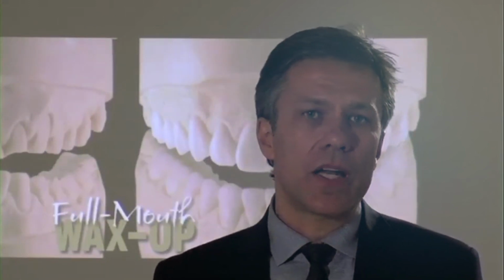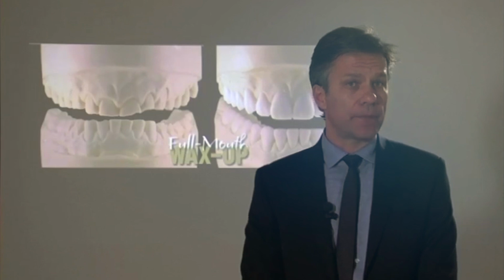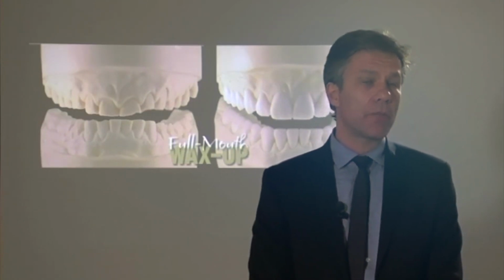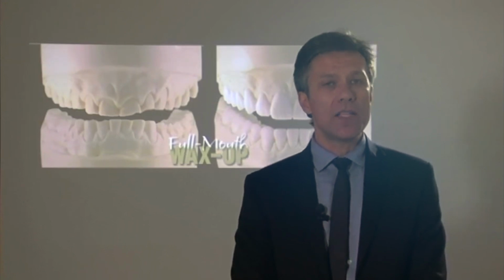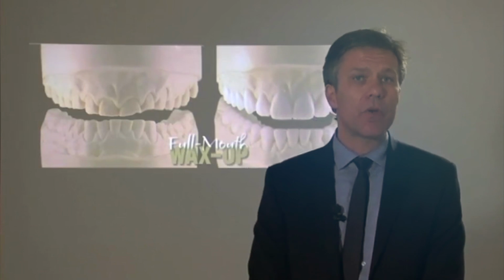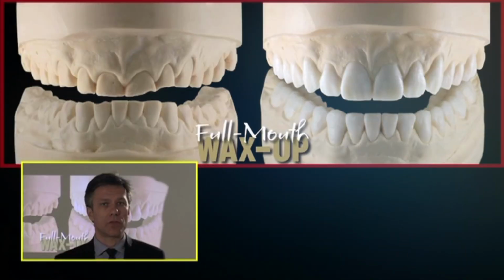So we think we should test the smile design before finishing our wax up. So we are doing only the buccal wax up. This buccal wax up will be tested in the mouth, and once it's tested and approved, then we're going to develop the full mouth wax up.